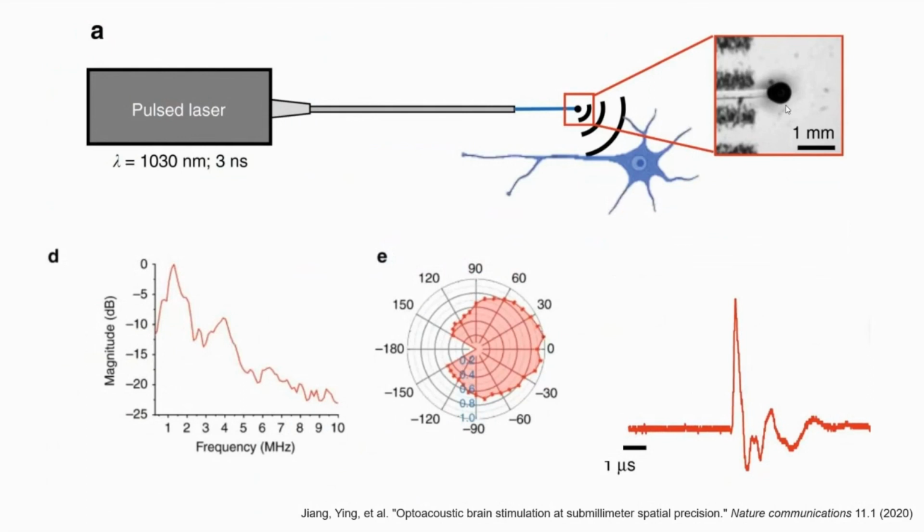And by pulsing this really quickly, I believe in his publication he pulses it at like 5 kilohertz, you create these actually complex ultrasonic frequency patterns. Here you can see the magnitude in decibels, so you have a logarithmic scale. And you can see that the predominant frequency produced with this tool is around 1 megahertz, which I would argue is very relevant to many of the tools that human and animal researchers alike are measuring.